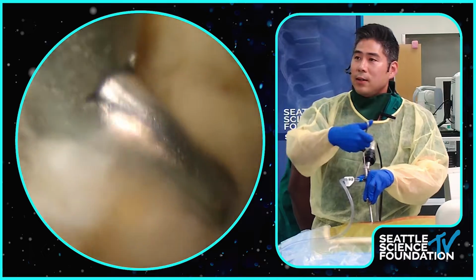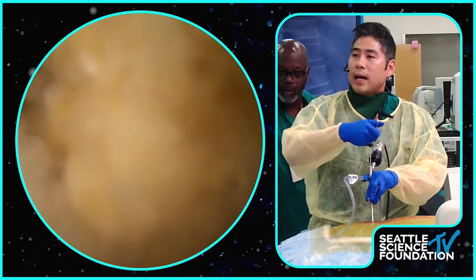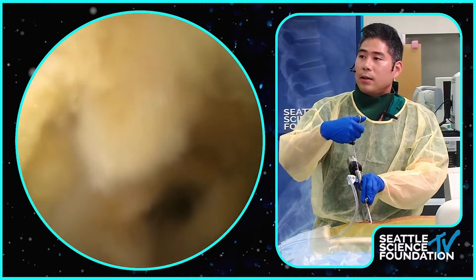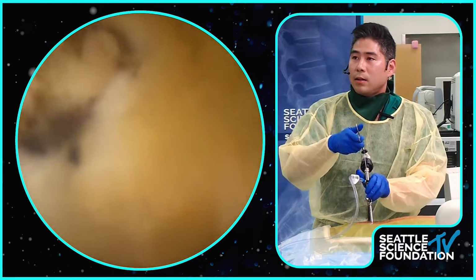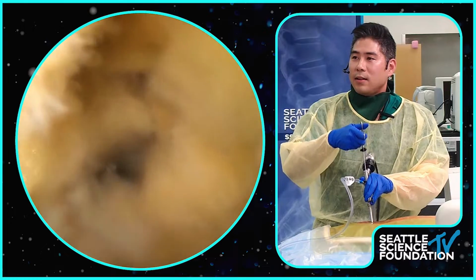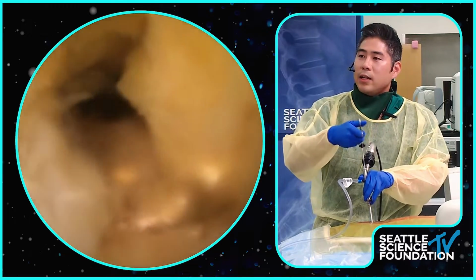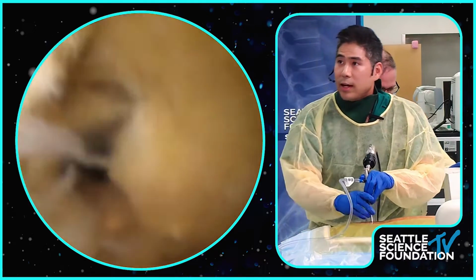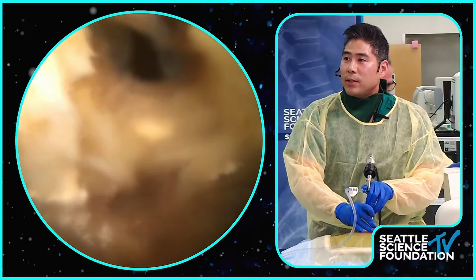So here I'm going to take down the yellow ligament. So John, going through here, for people that have not done this before, how scared are you that you grab the dura, and what are your tricks to avoid it? Yeah, so I go layer by layer here. This is the yellow ligament here, okay?